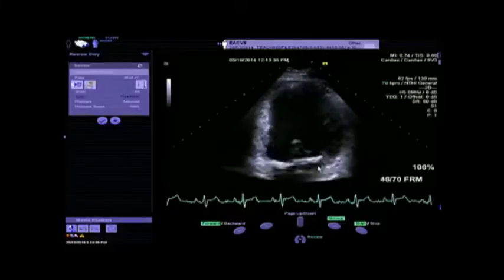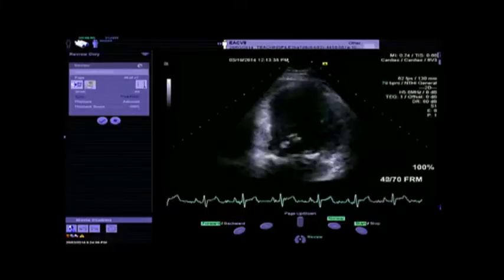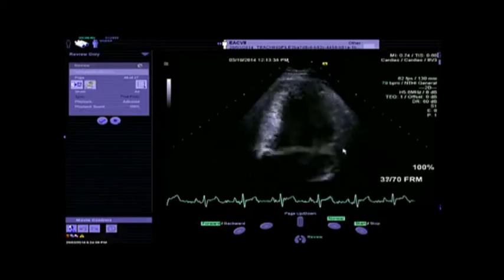And finally the redundancy, and we have seen that we have redundant tissue, but also the calcification and the extent of calcification. We have some extensive calcification of the posterior mitral annulus also extending to the lateral wall, which will be associated with a high risk of failure of mitral valve repair in these patients. So the likelihood of repair is very low.